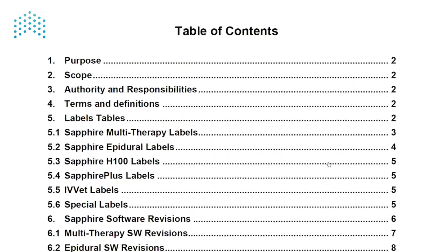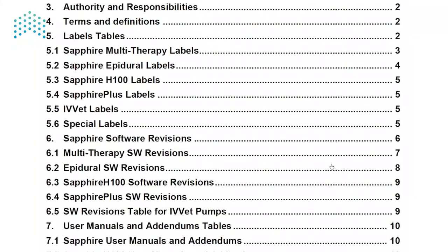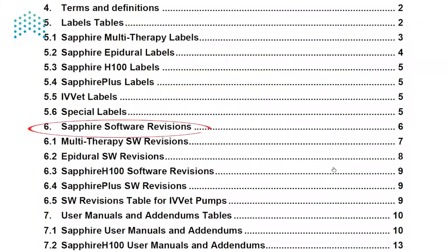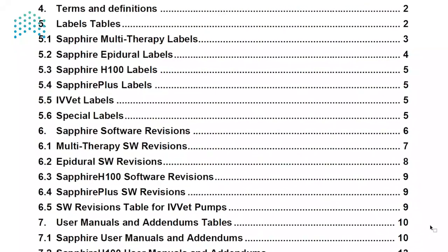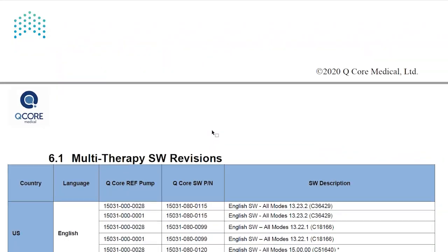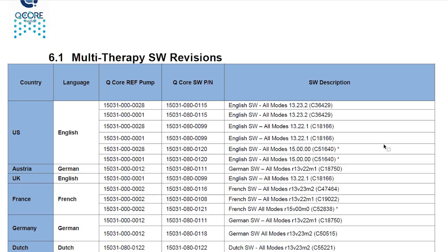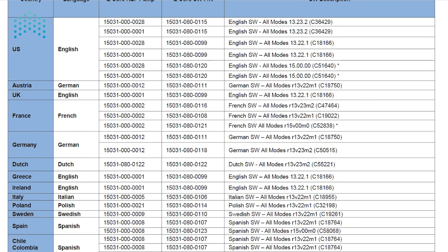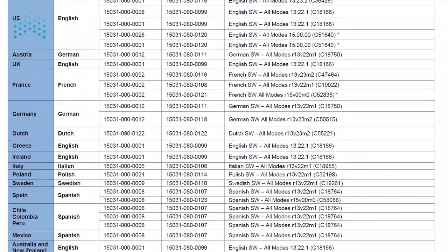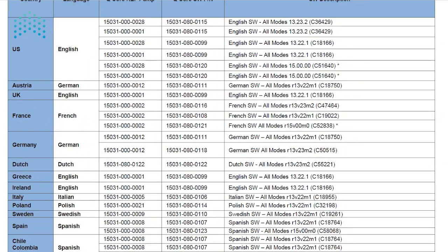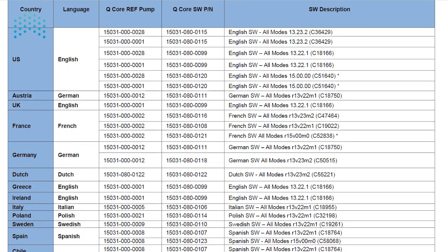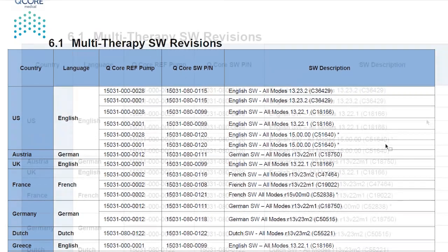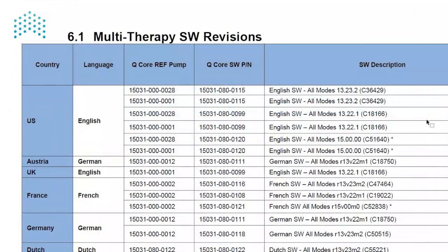In the document, under Section 6, you can find tables which match the pump's type and reference number to the approved software revisions. Unless the current software version is obsolete and doesn't appear in this document, we generally advise to return the customer's pump with the same software revision unless otherwise requested by the customer.